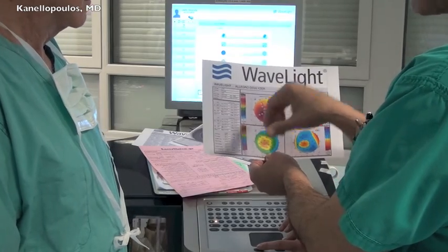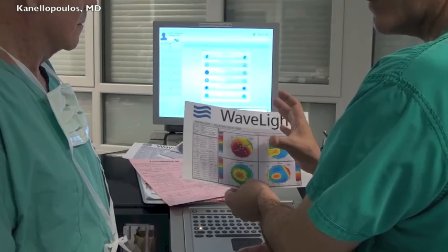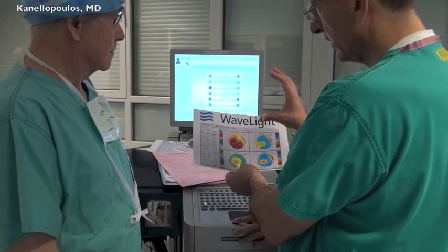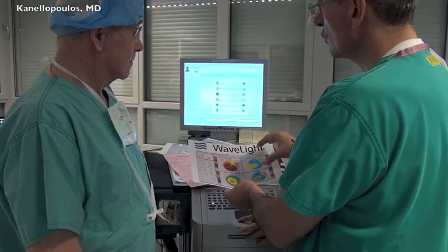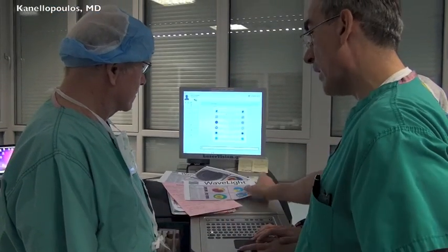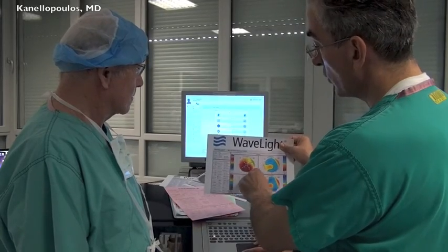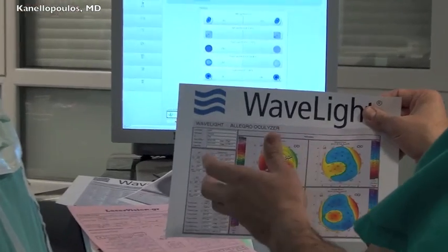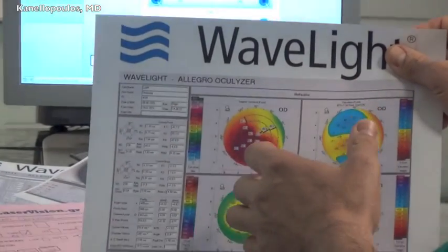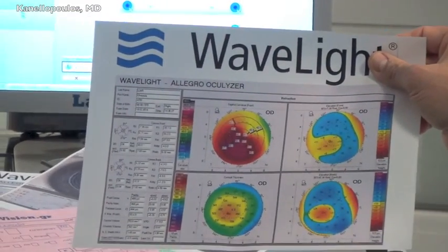So this may not always be the way we correct the astigmatism. We favor the topographic manifestation of the astigmatism rather than what the patients choose, and we have proven right on that choice because they have a multifocal cornea, and when they refract monocularly, they may throw you off of what actually the astigmatism is, not in the refraction, but in their cornea.